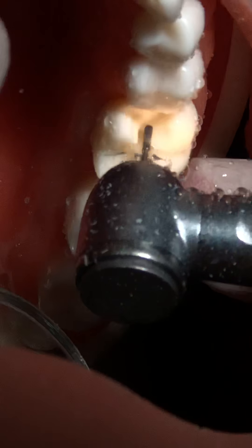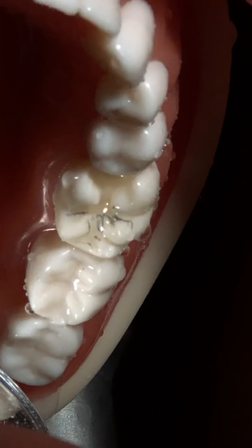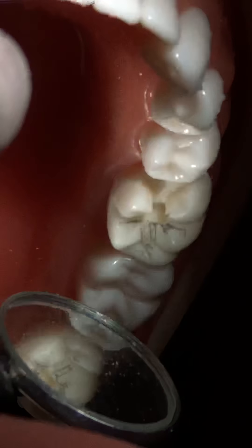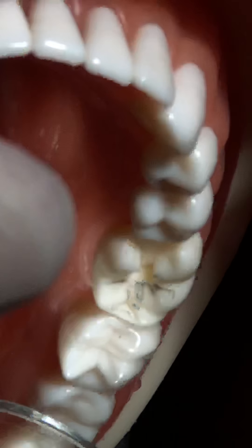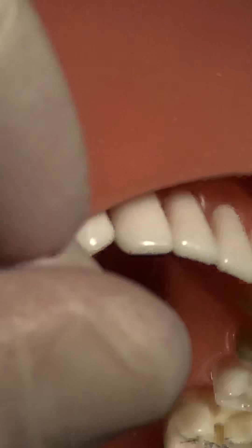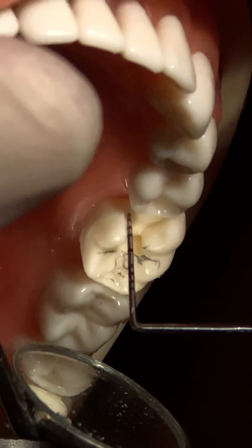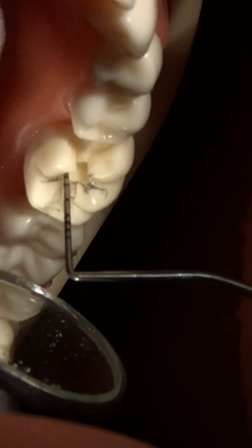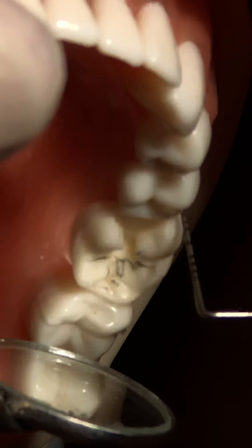You should use a chisel, but chisels cannot be used on plastic teeth - it's difficult to cut plastic with chisels. You should know the idea behind using a chisel: all undermined enamel is easily cut away with a chisel. Now you have the proximal part cut out. Check all the depths - depth should be uniform at almost 2 millimeters, or 1.5 millimeters - it is in both the buccal and lingual embrasures.